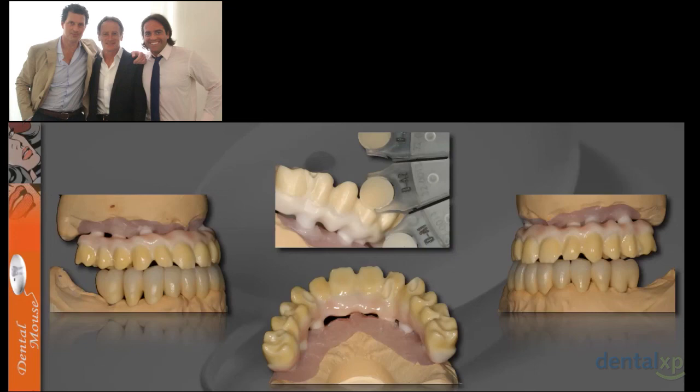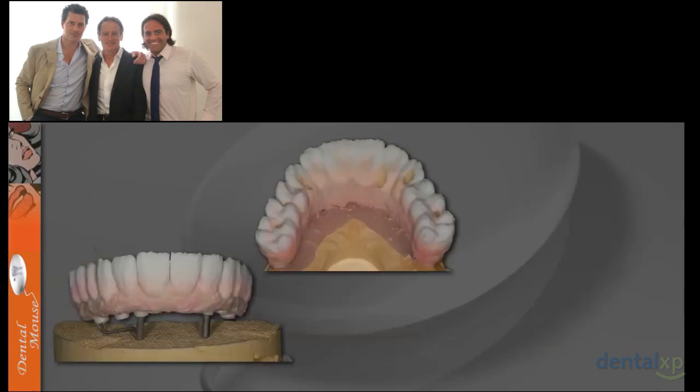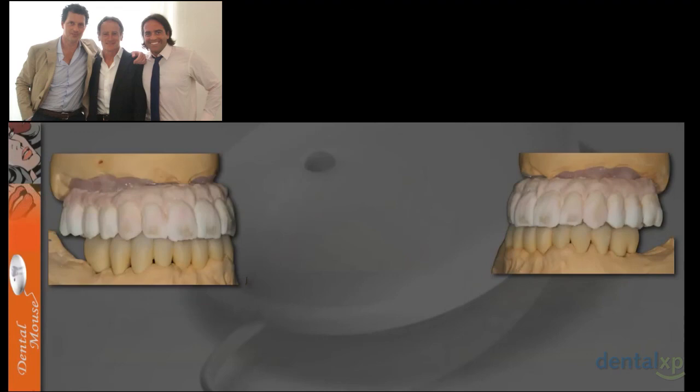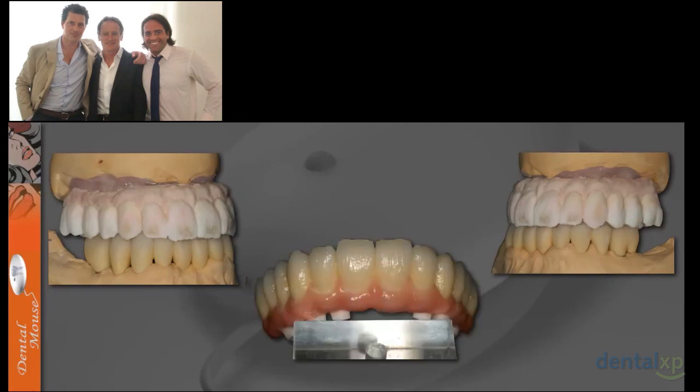Of course you have to choose the correct color. There is the first bake, then the second bake, and from there you can put more layers on top. This is the second baking, and then you can have the bisque bake.